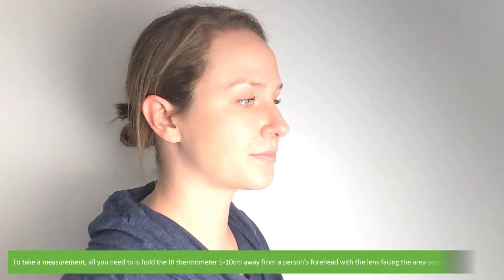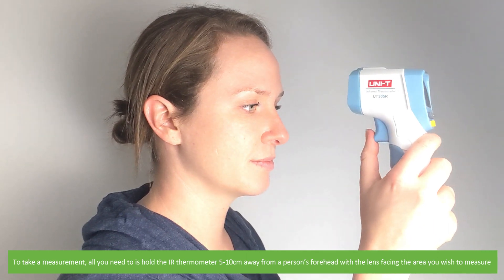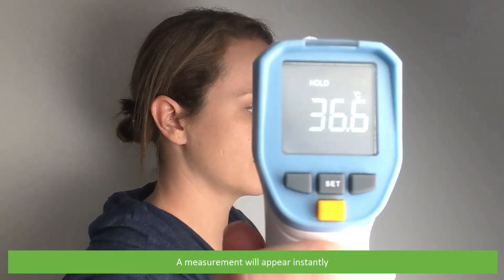To take a measurement, hold the IR thermometer 5 to 10 centimeters away from the person's forehead with the lens facing the area you wish to measure. Then press and release the trigger — a measurement will appear instantly.